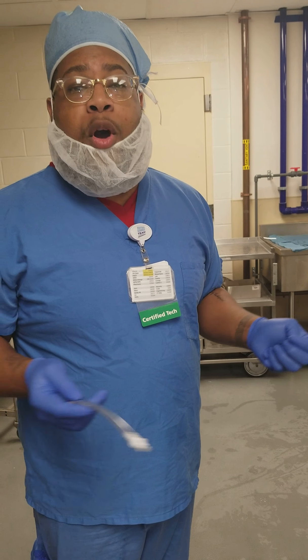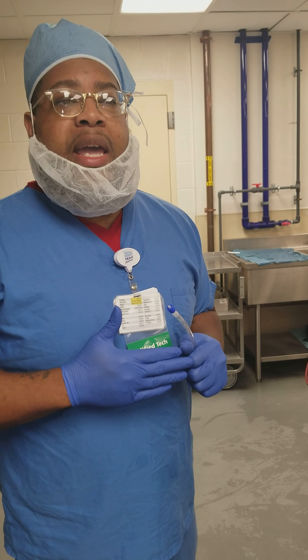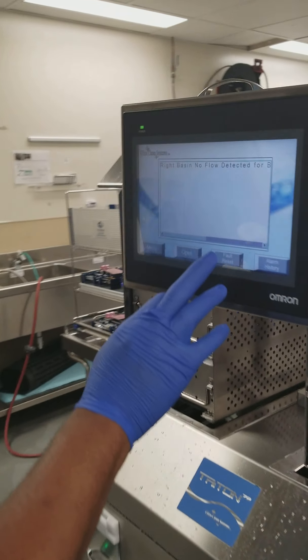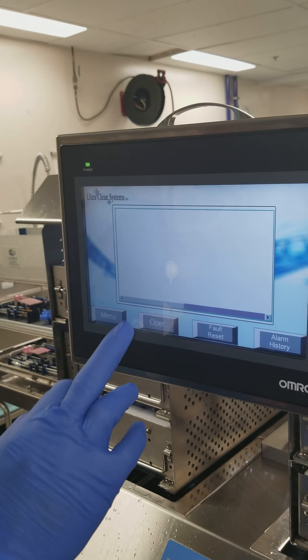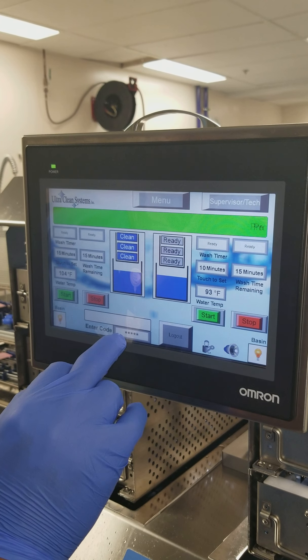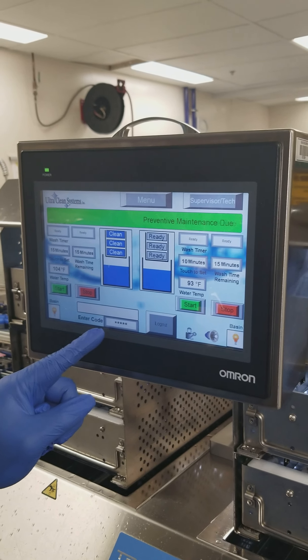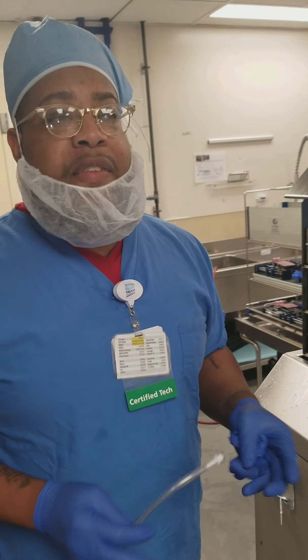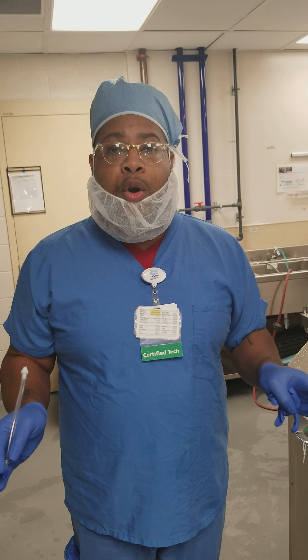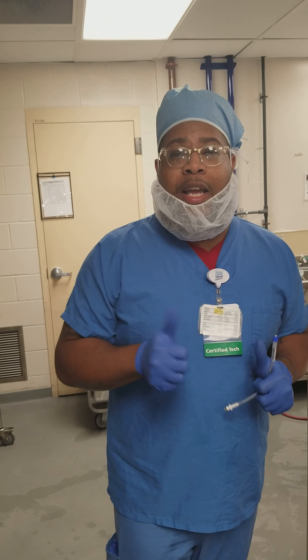That pretty much concludes my small in-service on the Triton 72. Another important feature to remember is that any alarm code can easily be factory reset. If you run into any errors, there's an enter code and that code is 9713. This is on any Triton 72 product that is sold — the factory reset code is 9713. Thank you so much for tuning in to SPD today.